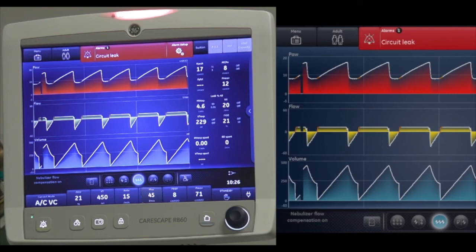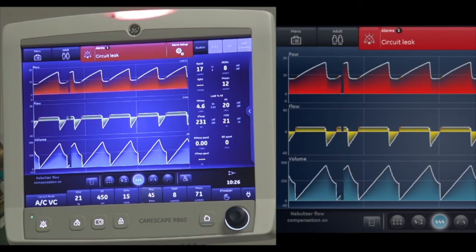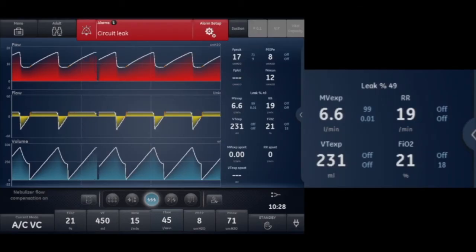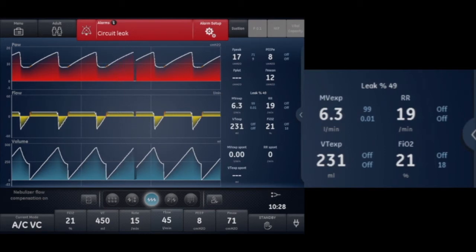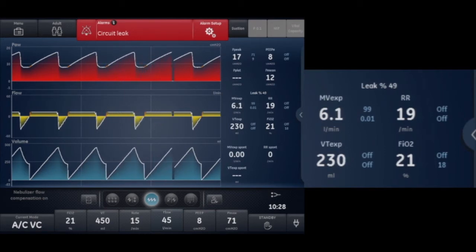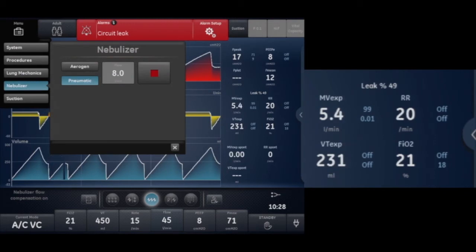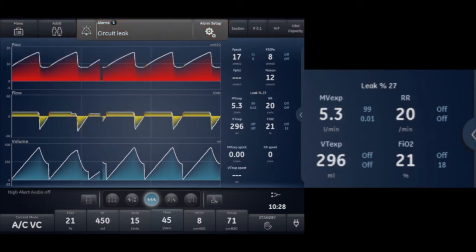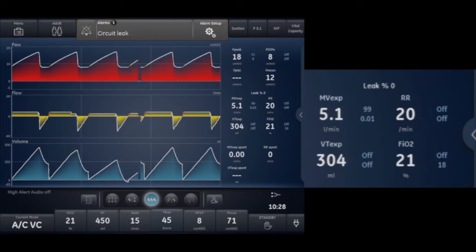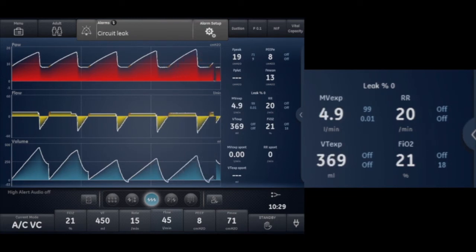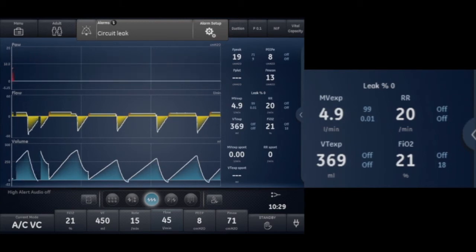As you can see in the alarm message at the top of the display, there is currently a circuit leak alarm. I enlarged the measured values on the right side to show the leak percentage — it's at 49%. The flow compensation is still turned on for the nebulizer. I'm going to turn it off and watch what happens to the leak. It immediately drops to 27%, and then there's no leak at all. This demonstrates how nebulizer flow compensation can create a leak — or make the ventilator think there's a leak — when the external source is turned off.